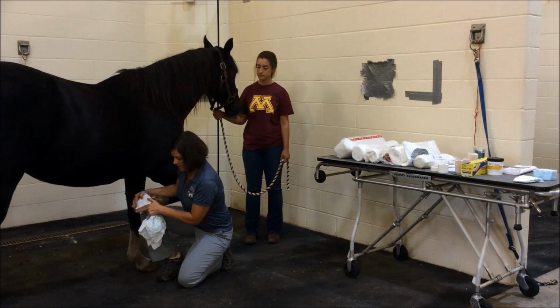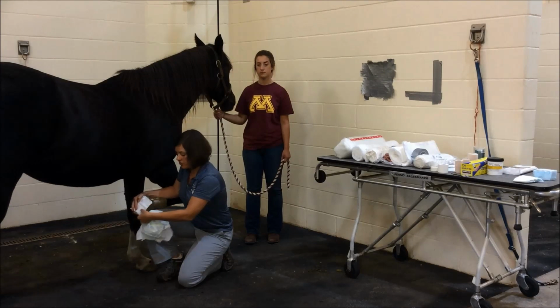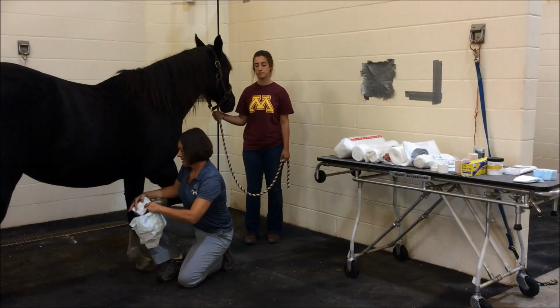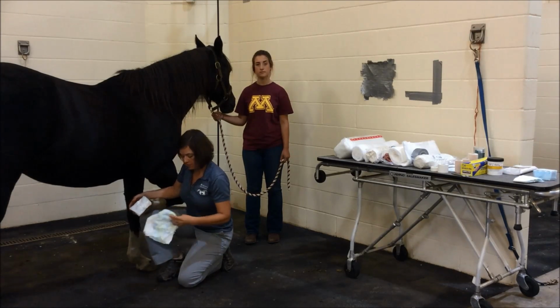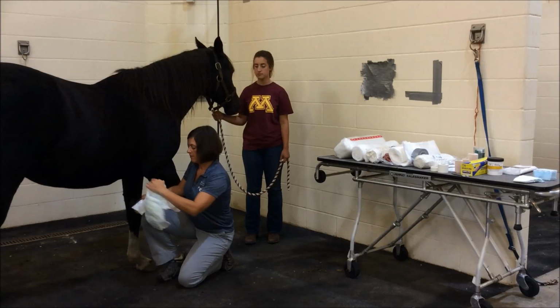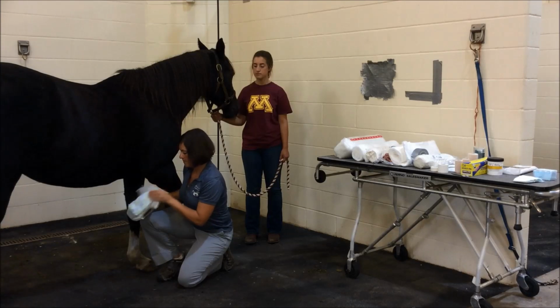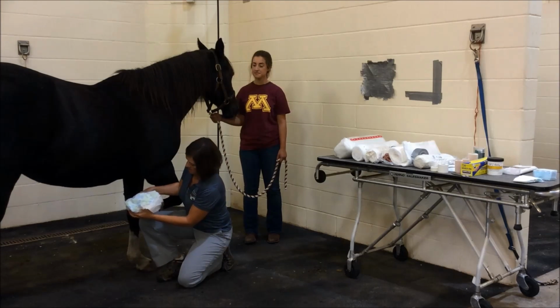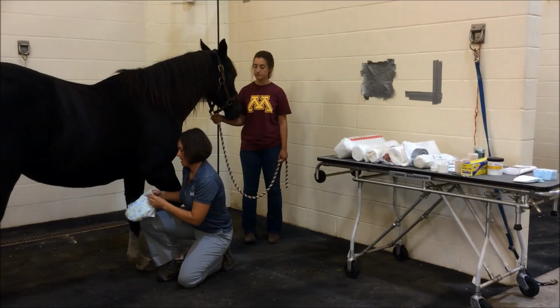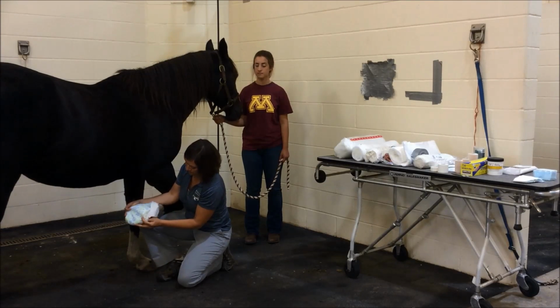So we'll put this over the sole of the foot. If you know where the abscess is located, you may want to make sure that this covers that particular spot, or if there's a target area that you suspect is where your abscess is located, make sure that you get good poultice contact there. And then I take the diaper with the tabs towards the heel bulbs. And then just like diapering a baby, we'll secure it with the tabs.